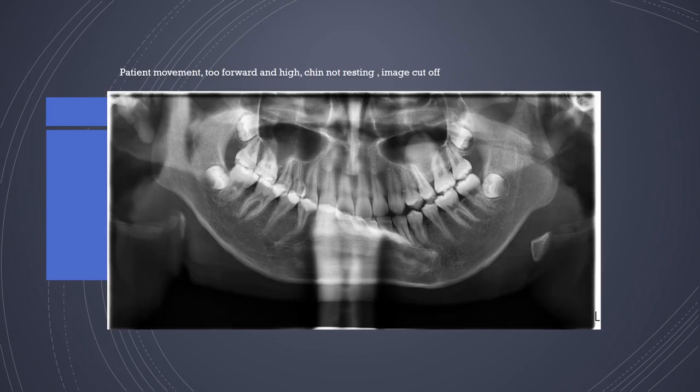This is another example of patient movement where the patient was placed too far forward and high, with the chin not resting on the chin support, resulting in the condyles being cut off. Combined with a heavy shadow of the spine, this image is totally non-diagnostic and must be repeated.